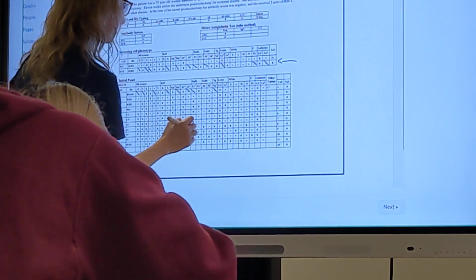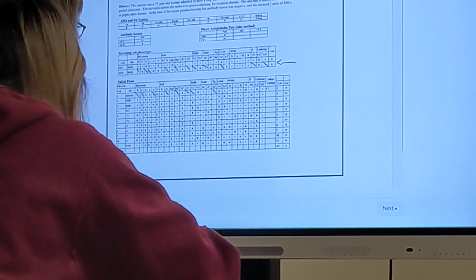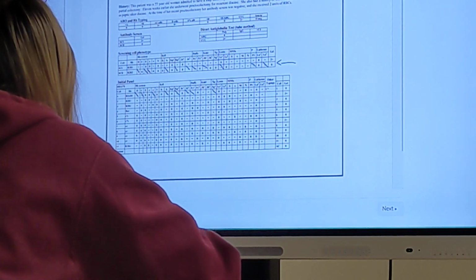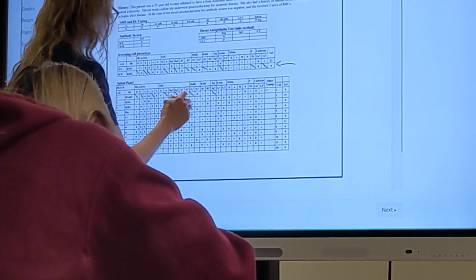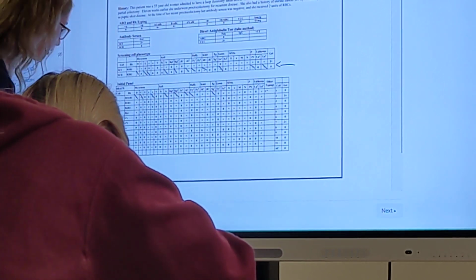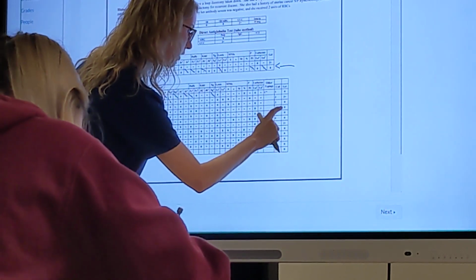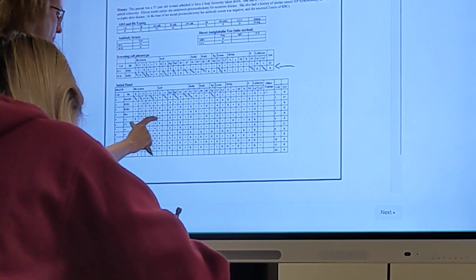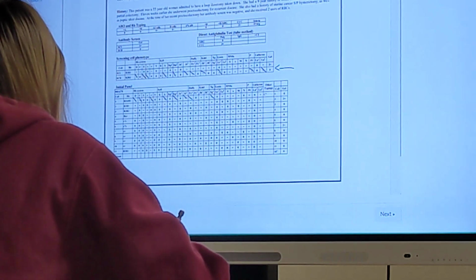Xga. I'm used to it being at the back. Where did you say you saw V? Right, it's after little e. Oh, yeah. Don't worry about that one. It can be hemolytic. You didn't have any reactivity, so if it's present and you didn't react there, then I wouldn't worry about it.